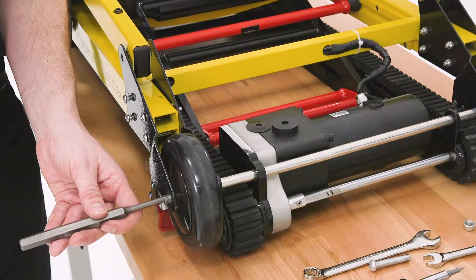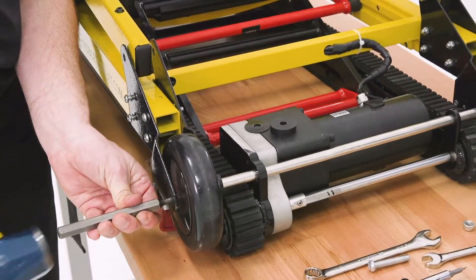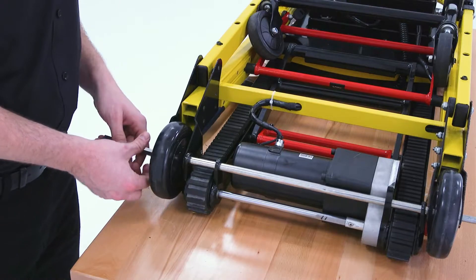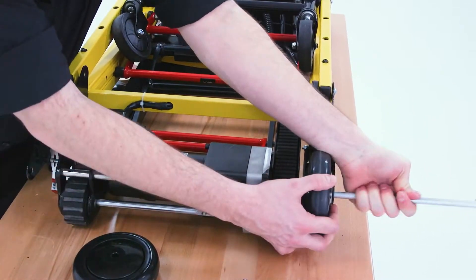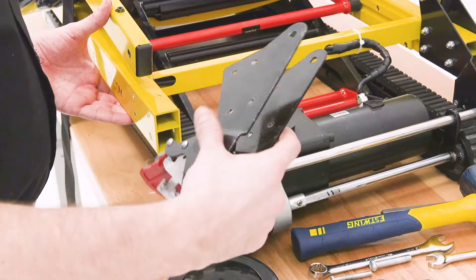Then align the punch with the axle and hammer the punch to slide the axle out. When the axle has been hammered beyond the wheel, slide the wheel towards the bottom of the chair to remove it. Then pull the axle completely out from the opposite side and place it and the second wheel aside. The bracket will now slide off.